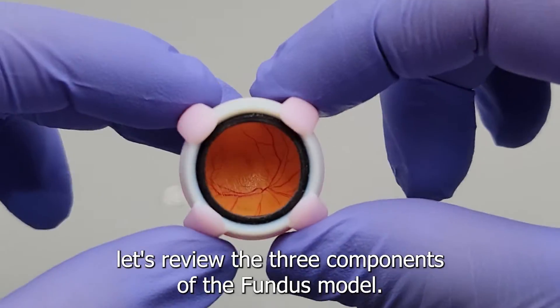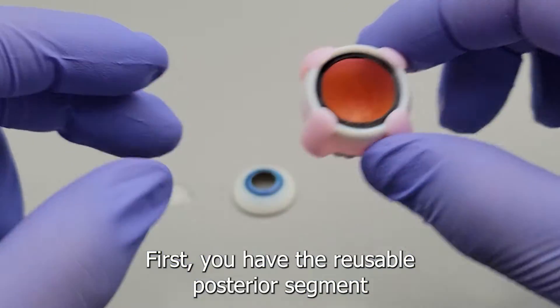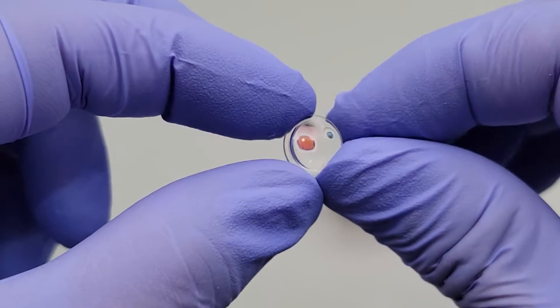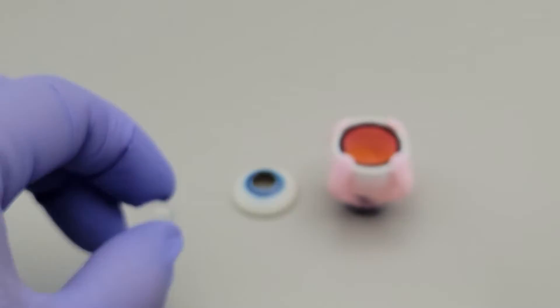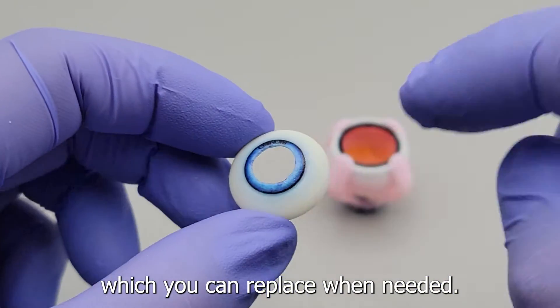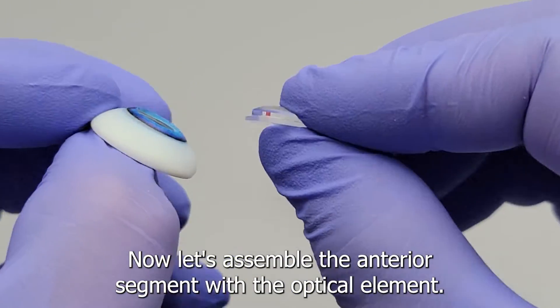A faster assembly method will be shown next, but first let's review the three components of the fundus model. First, you have the reusable posterior segment with the realistic fundus image. Then you have the reusable optical element that simulates the power of the eye. Lastly, you have the anterior segment, which you can replace when needed.